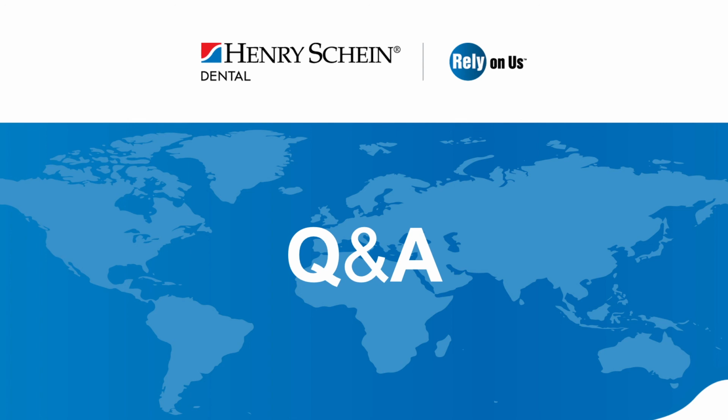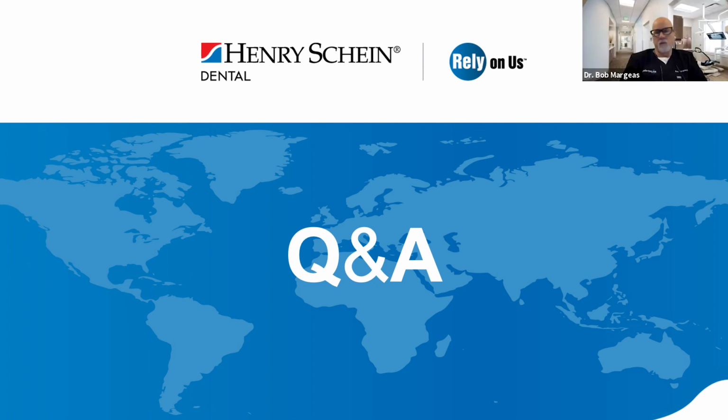All right, we'll make this the last question tonight. Do you ever place a protective resin coating on the finished surface of the restoration? I never used a Fortify or a Discover. I want to get a high shine, and going through the system that I use, showing the discs, the groovy diamond polishers, and the Enamelize on a Flexibuff. The surface sealer will give you a high shine, but it won't last more than a year or 2. So I do not like surface sealers, and I can't get the surface texture the way I want it.